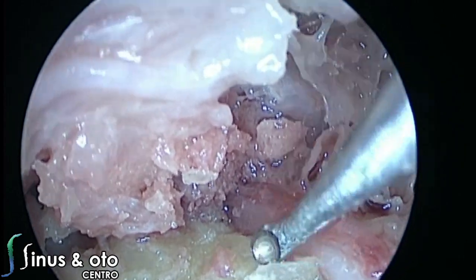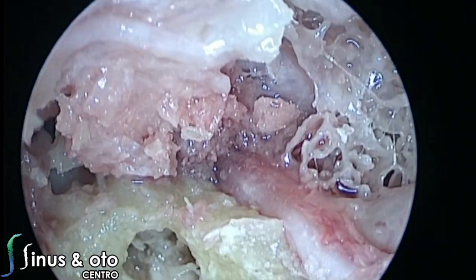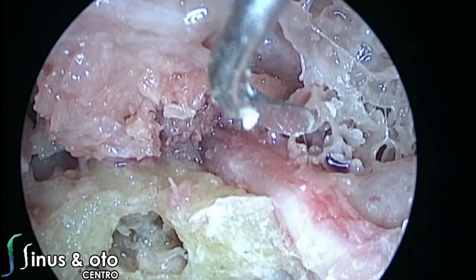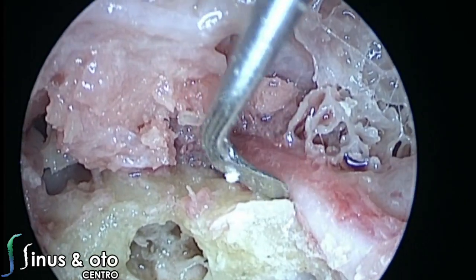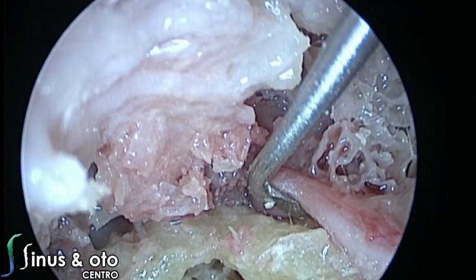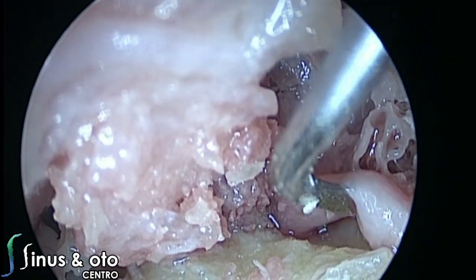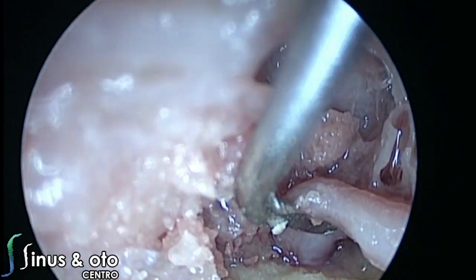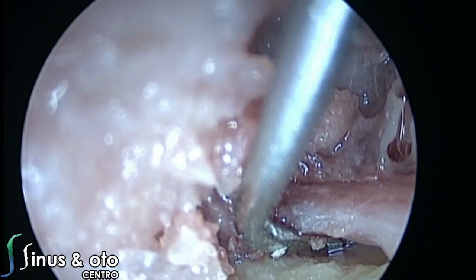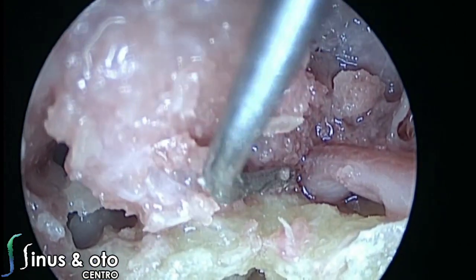We can also try to elevate the facial nerve to see where the facial nerve goes inside the labyrinthine segment in the inner ear. And of course, the facial nerve is a little bit more thick when compared to the greater petrosal superficial nerve. So we elevate the tympanic segment of the facial nerve. This is a dissection only, so it's just a demonstration for you to understand. And we see the facial nerve going in the labyrinth and going into the inner ear.